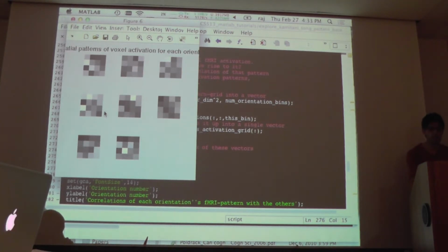Most, at the present moment, and I'm not saying for one minute that this is an optimal way to do it, which is why I'd be interested in looking at this thing I just mentioned. Most pattern analysis at the moment basically says, step one, take your pattern, stretch it out into a vector. It's really just for computational convenience that people do that. And because that kind of works okay, people haven't worried that much about the fact that you're losing some spatial information. But maybe people should worry about that, and that's on my list of things I'd like to look at at some point.